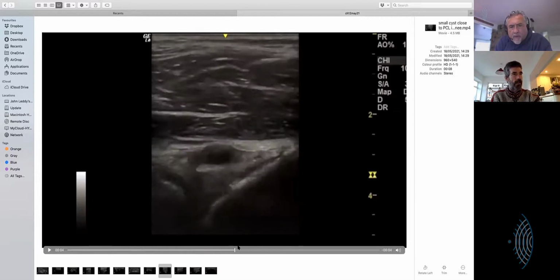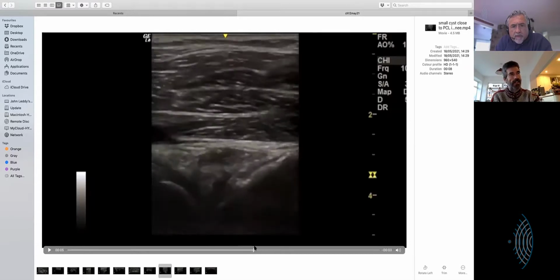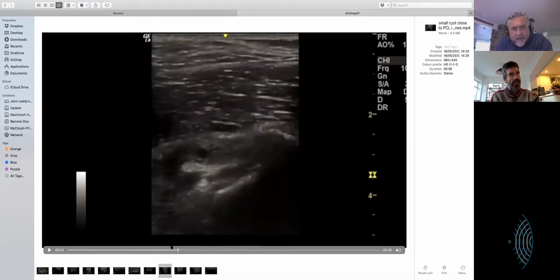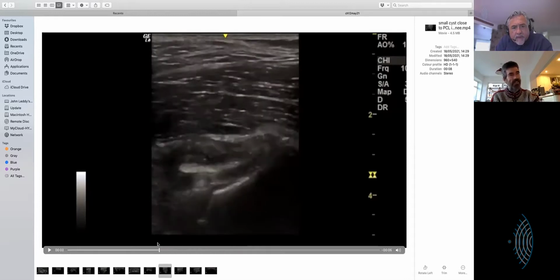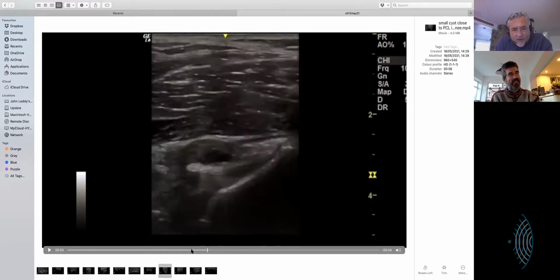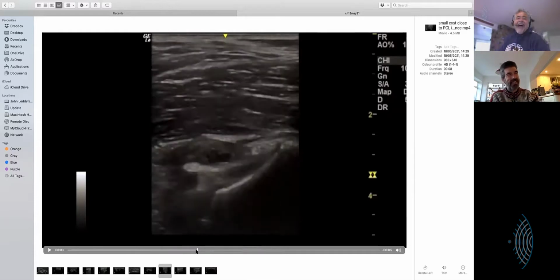I'm not even knowing where we're oriented. Go on then, try and have a guess. I'm seeing what looks like the glenoid on the left. You're on the wrong continent. Wait, just a second. Oh, we're 4 centimeters down. No, you're not in the wrong state, you're on the wrong continent. This is South America.